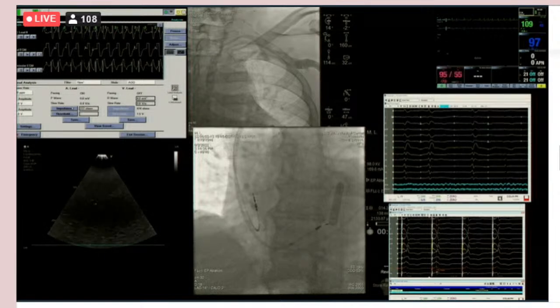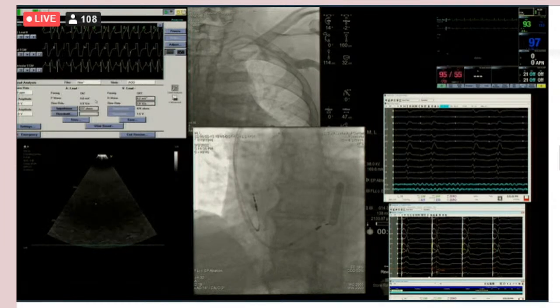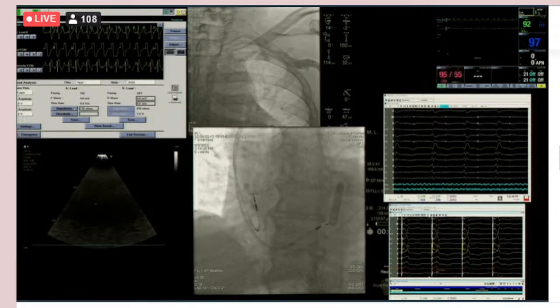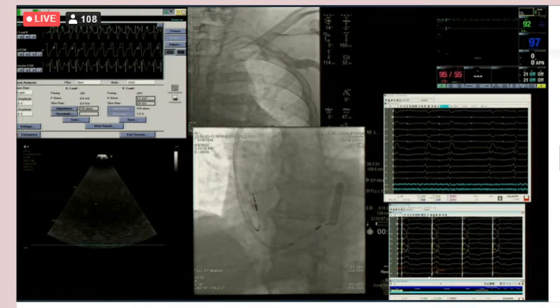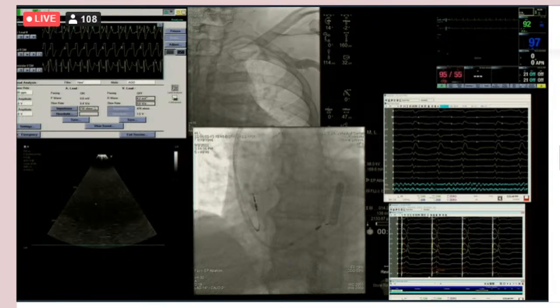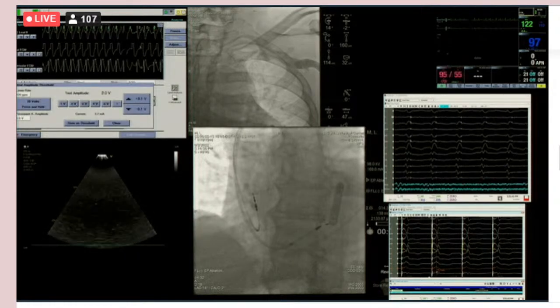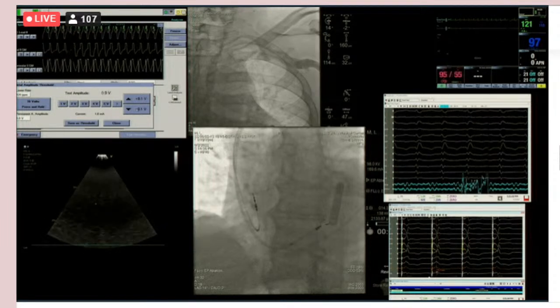I realize there's no trial supporting that, but when you can combine conduction system pacing, when you get an R prime in V1 like that, and you still have an existing RV lead, you can play with the timings and really get a super narrow QRS, sometimes super physiologically narrow. And in the scenario that you're describing, we know the origin of the cardiomyopathy is RV pacing. So you correct that directly.